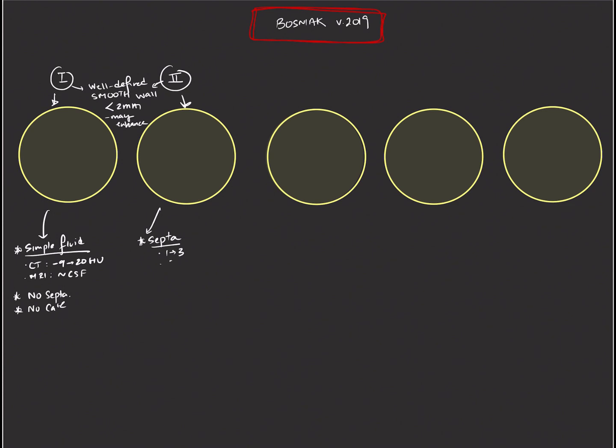In terms of septations, Bosniak 2 cysts are allowed to have anywhere from 1 to 3 thin septations. When we say thin septations, we're talking about septations that are less than 2 millimeters in width. Here you can see two septations within this otherwise simple cyst. We don't worry about those, and we classify these lesions as Bosniak 2. These septations within these cysts may enhance. We're not too worried about those, as long as they're thin and there are few of them.